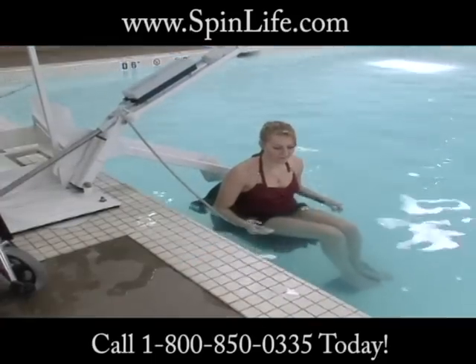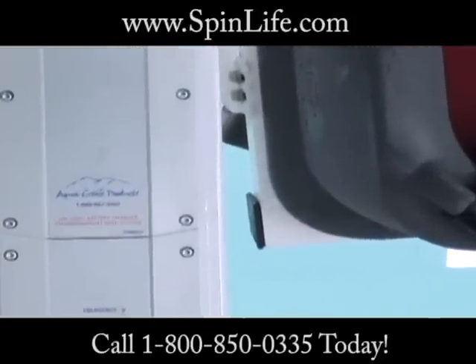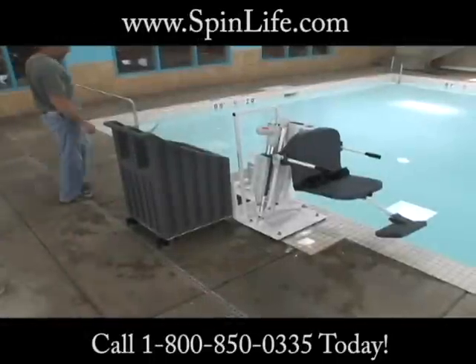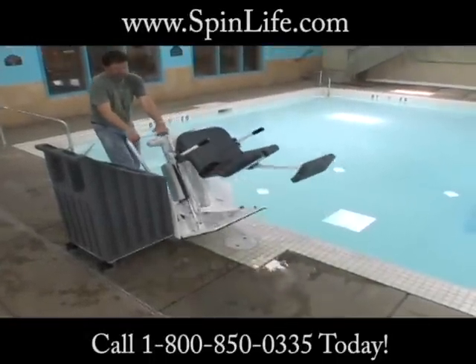The Pro Pool Lift is mounted to a durable cart, constructed of the same corrosion resistant, powder coated stainless steel materials you've come to expect from all Aqua Creek lifts. The unique design of the cart allows the lift to be stowed in line with the weights, to fit through a three foot wide doorway.